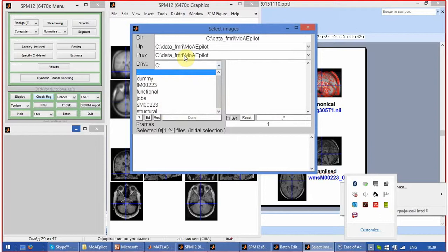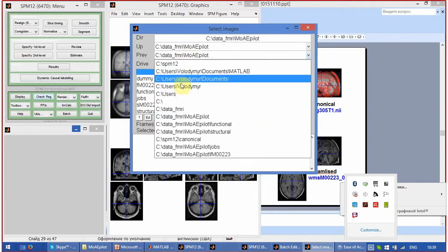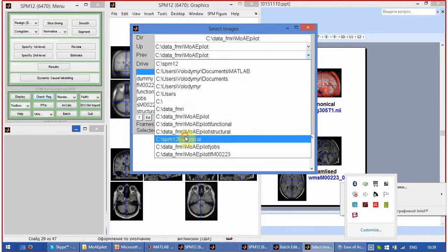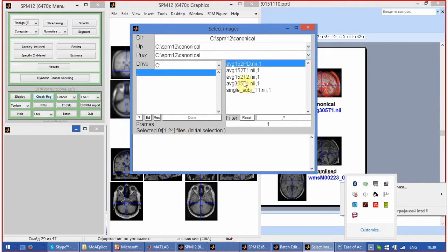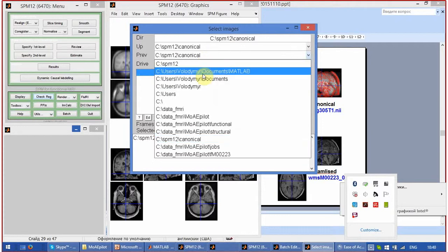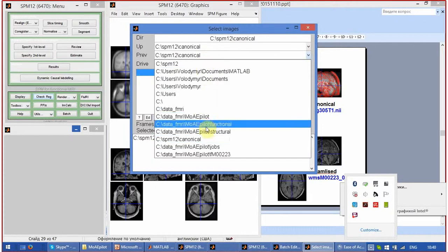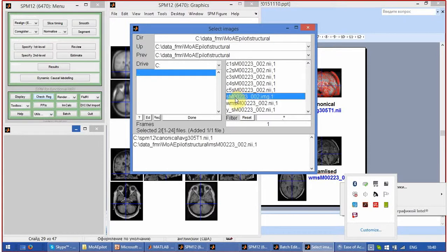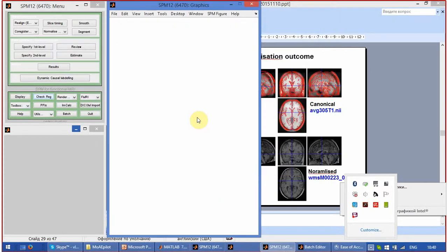Go to structural and pick MS image, which is the bias corrected image. Bias corrected structural image before the normalization. Click done.